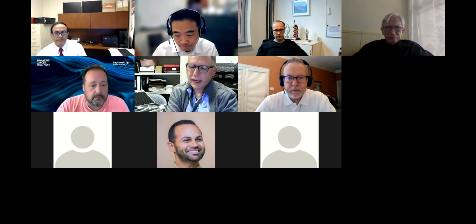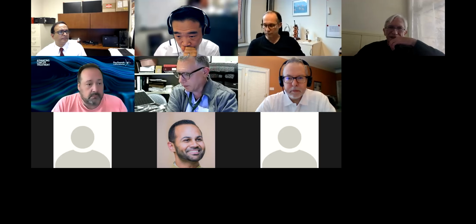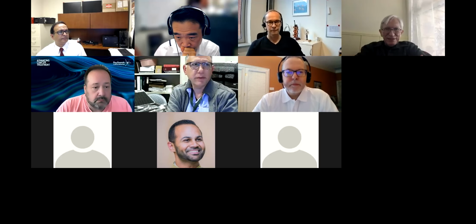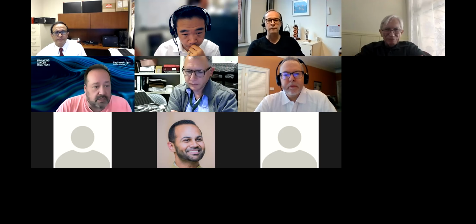We'll see how long this task group takes. Bruce, do you know our timeline? Is it another year? Hopefully we will get to it. I've lost track of where we are on it, but the goal here is to have comprehensive guidelines. You could probably use some of that at some point. Yeah, that'd be great. We could set something up, Aline, after the release, and when we're coming up with the new release, we can do something like this again and show you what we're working on, get your input, because it's very important to us that we do this right.